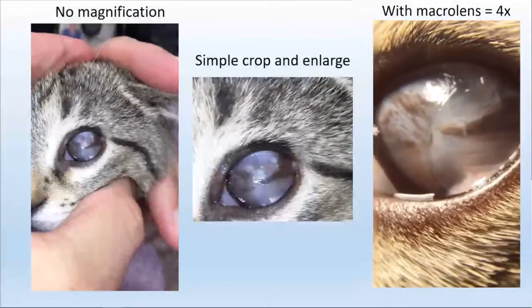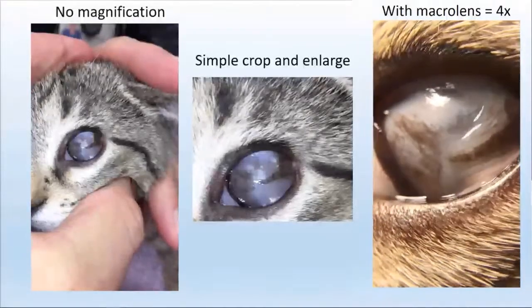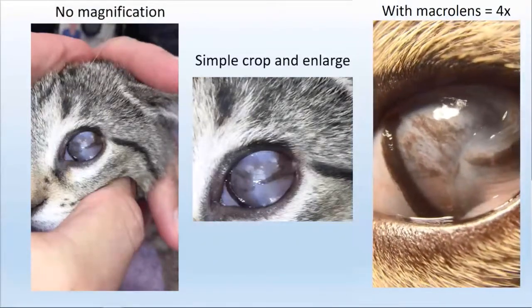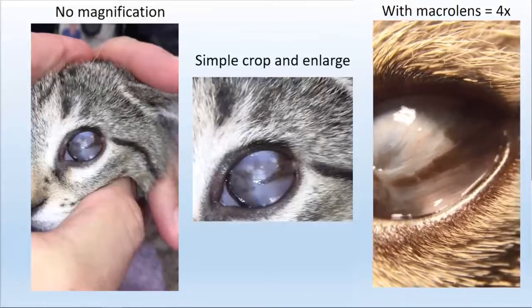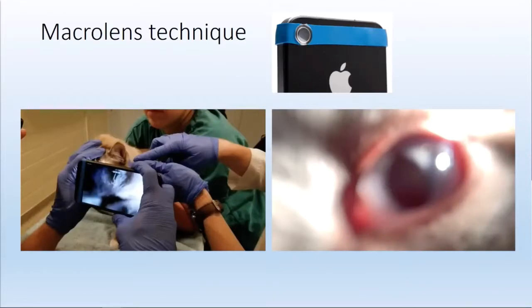But I could zoom and crop into this video and get up to 8x magnification, maybe do it again, 16x magnification. It is an incredible resource that just allows us to basically replace those $1,000 cameras. And I love the fact that we can get compressed videos really easily. Videos allow us to get different focal points and different things in focus.